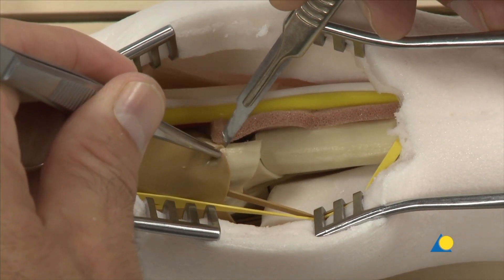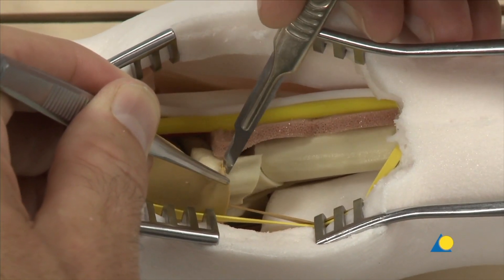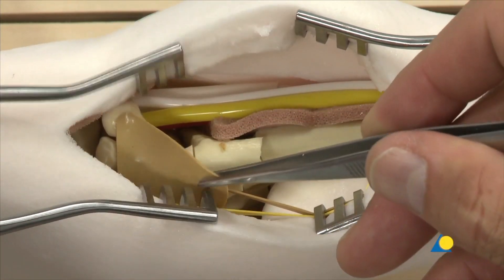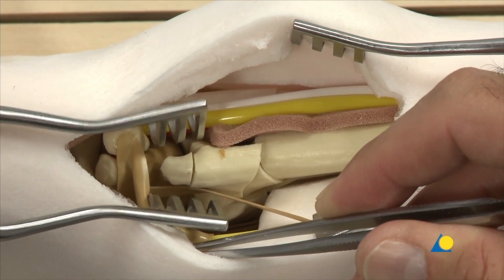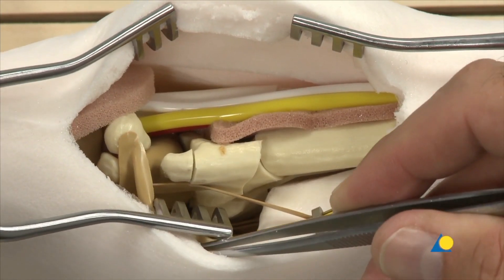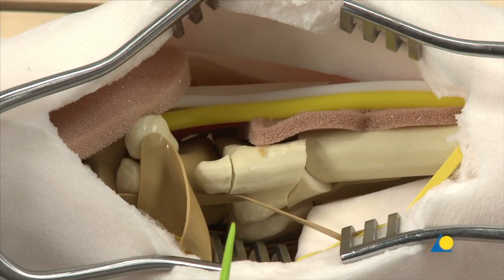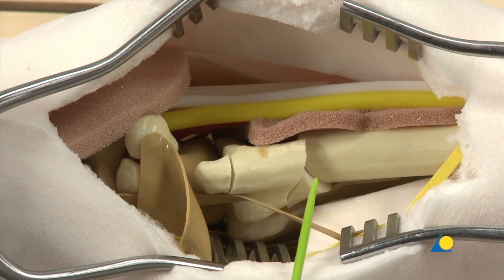The retinaculum is incised and retracted along with the dorsal sensory branch of the ulnar nerve. This exposes the styloid fracture, the subcapital fracture of the distal ulna with diaphysial comminution, and the ulnar shaft.